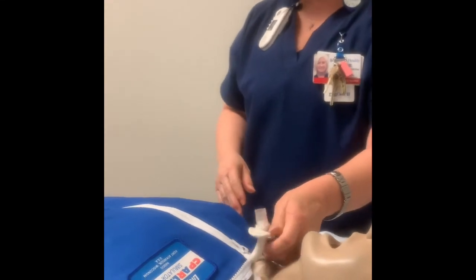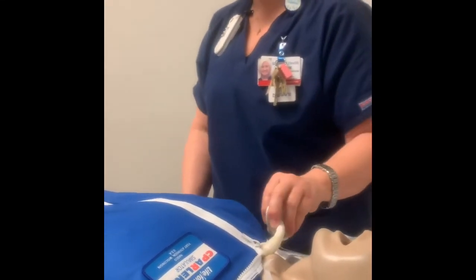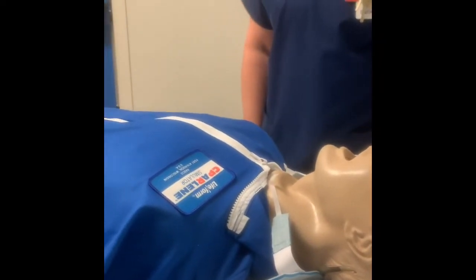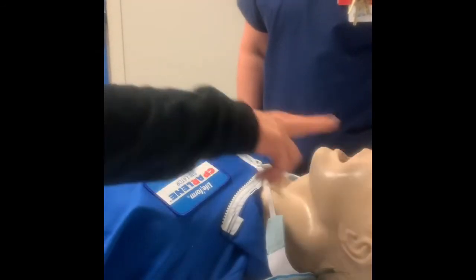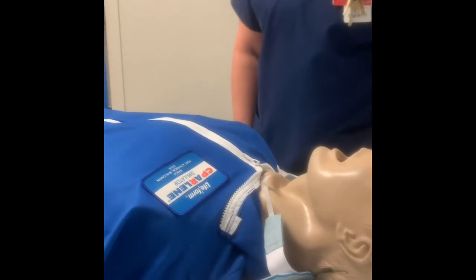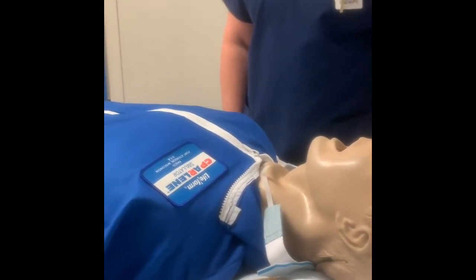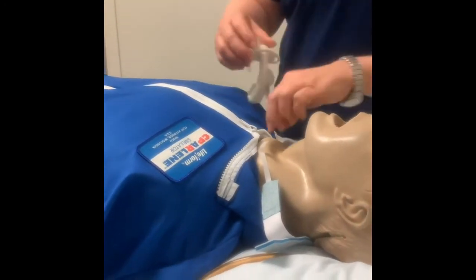And I have a trach tube in that falls out. What am I gonna do? Pop on up. Sorry, that's okay. I'm going to call SWAT. It's partial, you said? Partial laryngectomy. So call SWAT, and I could ventilate either place. And that's all you do, just wait for someone else to come re-put the tube back in, okay?